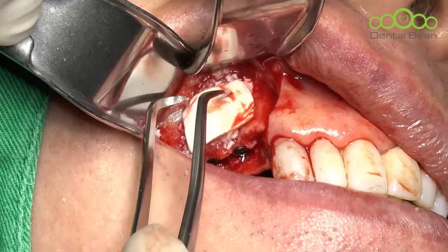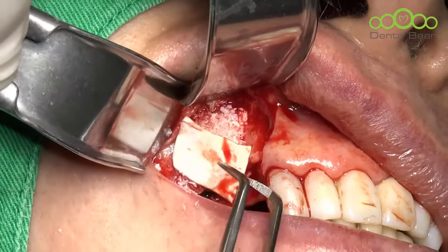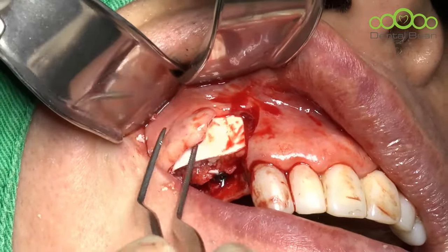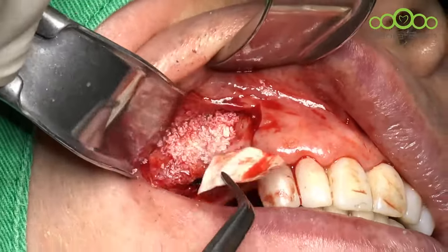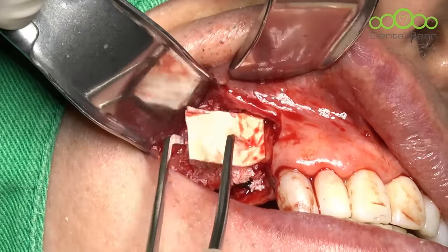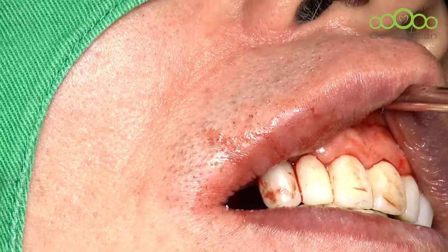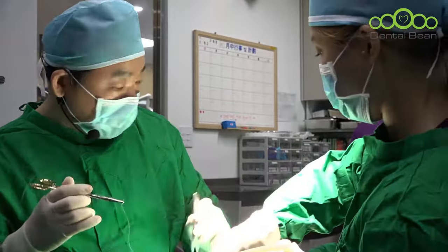Speed? Okay, a question came from China. One dentist asked me what kind of speed I used during the drilling. Usually I like to use 800 RPM. You can use slow speed, less than 100 RPM, but I prefer high speed. Anything is fine. You can control the surgical machine at less than 100 or about 800 RPM. If you focus on safety, please reduce the speed. However, if you focus on efficiency, you can use 800 RPM.